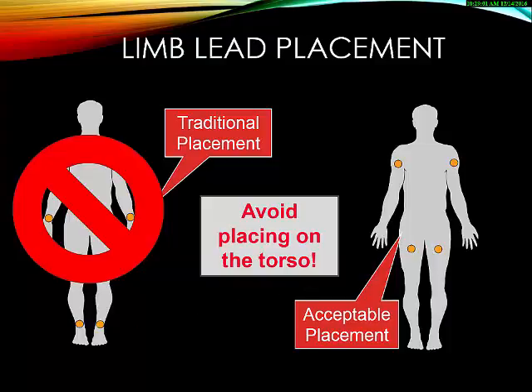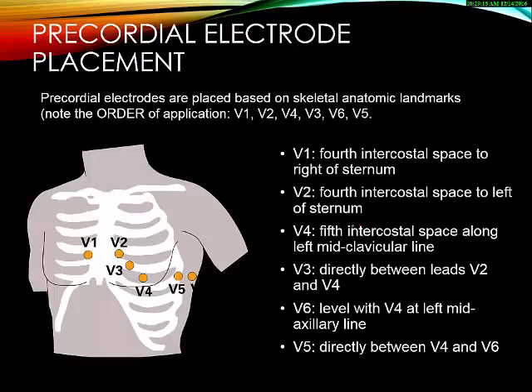We can do this here, but you have to really make sure your patients aren't moving around too much. In the hospital setting, they can lay on a big bed and not move for you. In our setting, we're doing it on a couch or in the back of the moving ambulance, and some of the movement of the extremities can cause artifact and make it difficult to read a 12 lead.